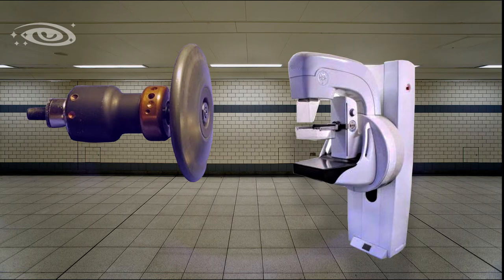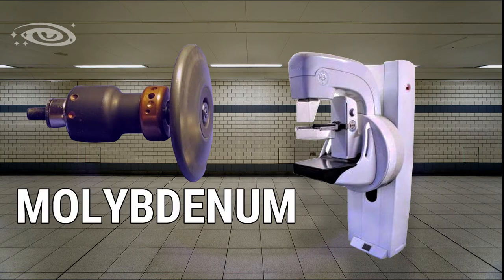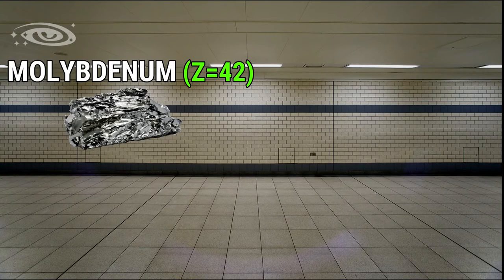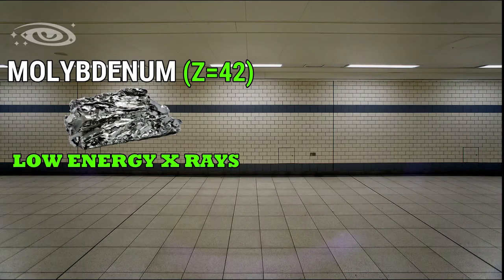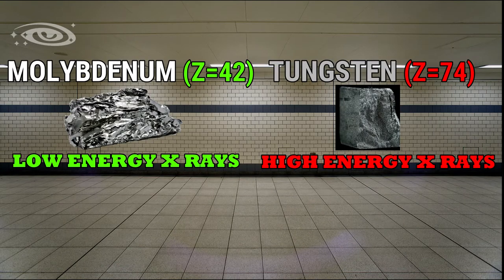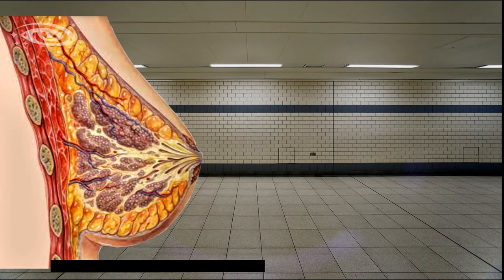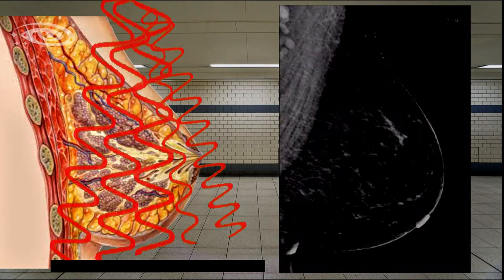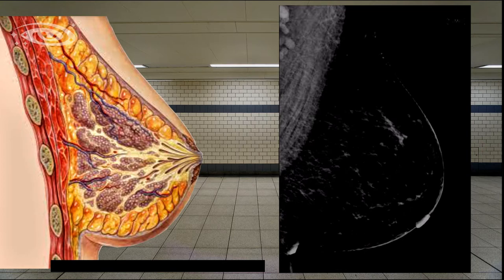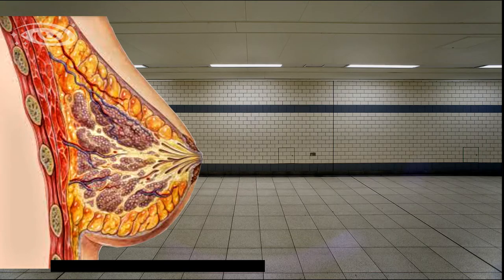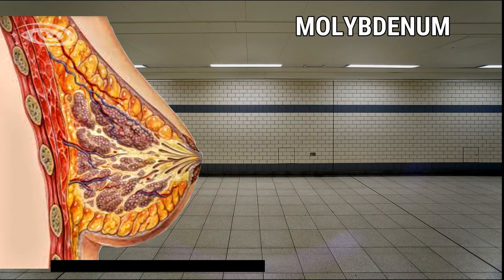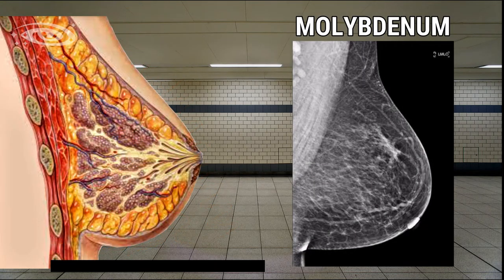But one thing in mammography machines, the target disc is not tungsten, the target disc is made up of molybdenum. Because molybdenum produces low energy X-rays. But tungsten produces high energy X-rays. The breast tissues are soft tissue, so if you use high penetrating X-rays, we cannot get details on the image. The image is going to be overexposed. So we need low energy X-rays, so molybdenum is suitable for producing low energy X-rays.